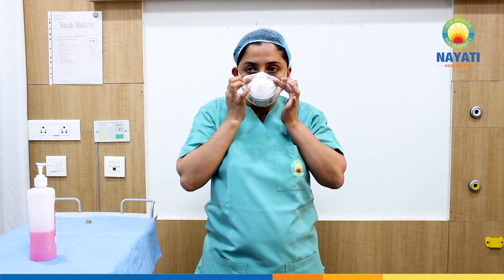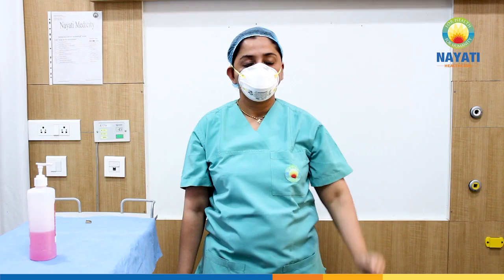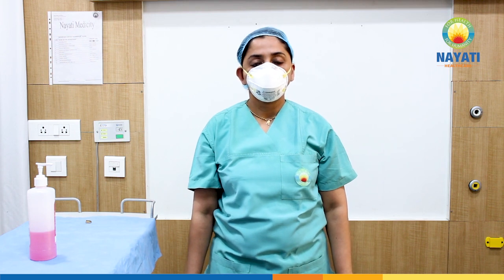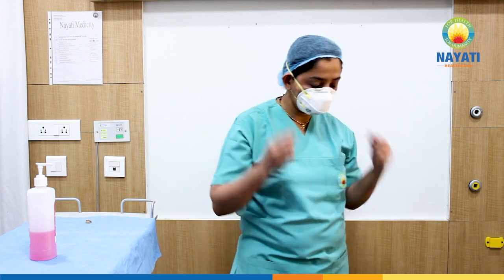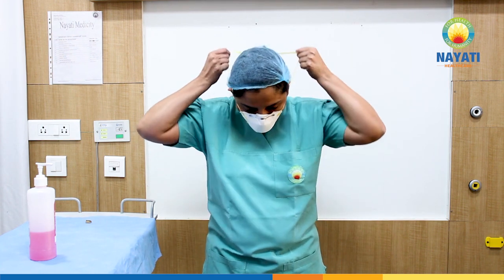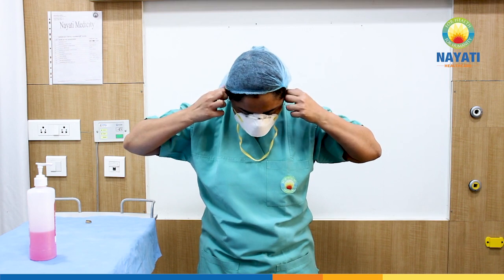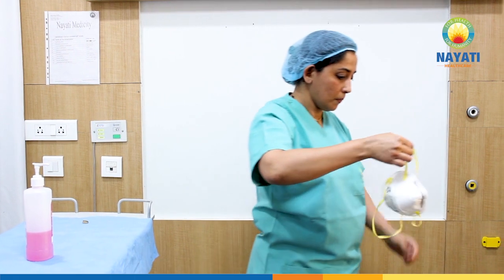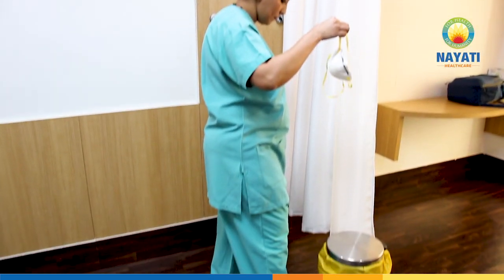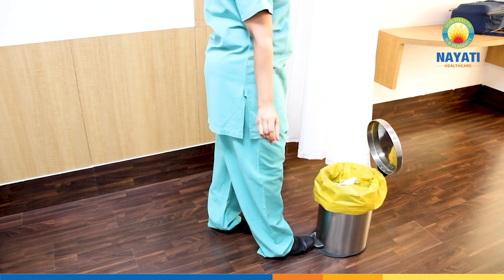Perform a fit check by breathing in and out. To remove the N95 mask, tilt your head forward. Use two hands to grab the bottom strap, pull to the sides then over your head. Use both hands to grab the upper band, pull to the sides and then over your head. Keep tension on the upper strap as you remove it. Let the mask fall forward. Do not touch the mask surface. Discard in an appropriate biomedical waste container — a yellow bin in our case.